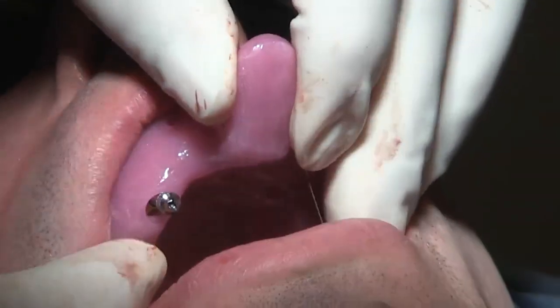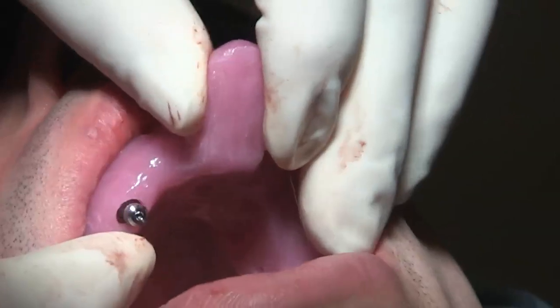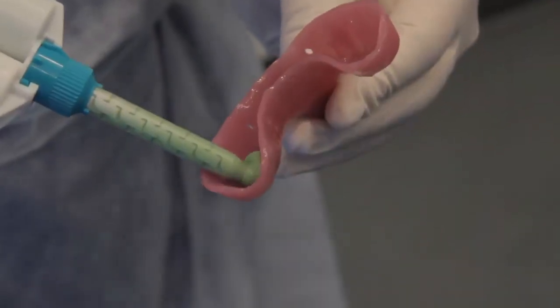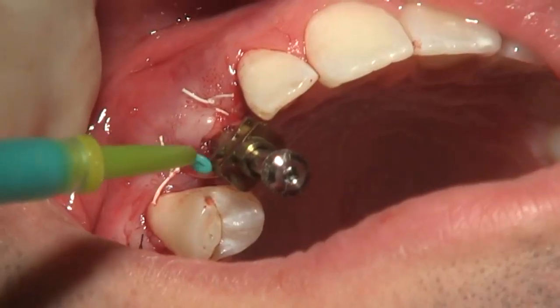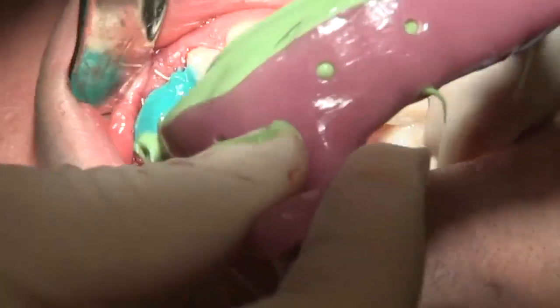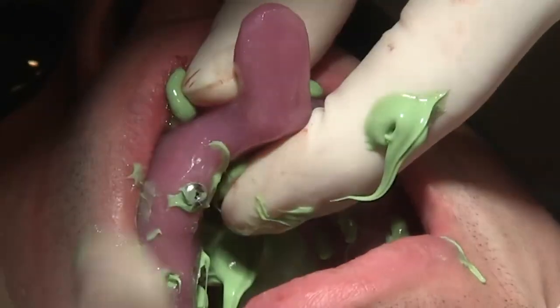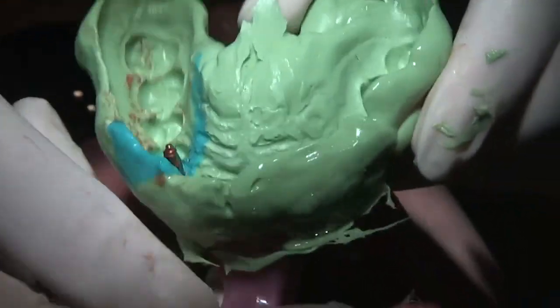A custom tray is being used to take the impression of the implant with the open tray coping. Impression material of choice is being used in the implant site as well as in the tray. Careful attention is being applied that the coping is accessible for the screwdriver and an accurate impression can be taken.